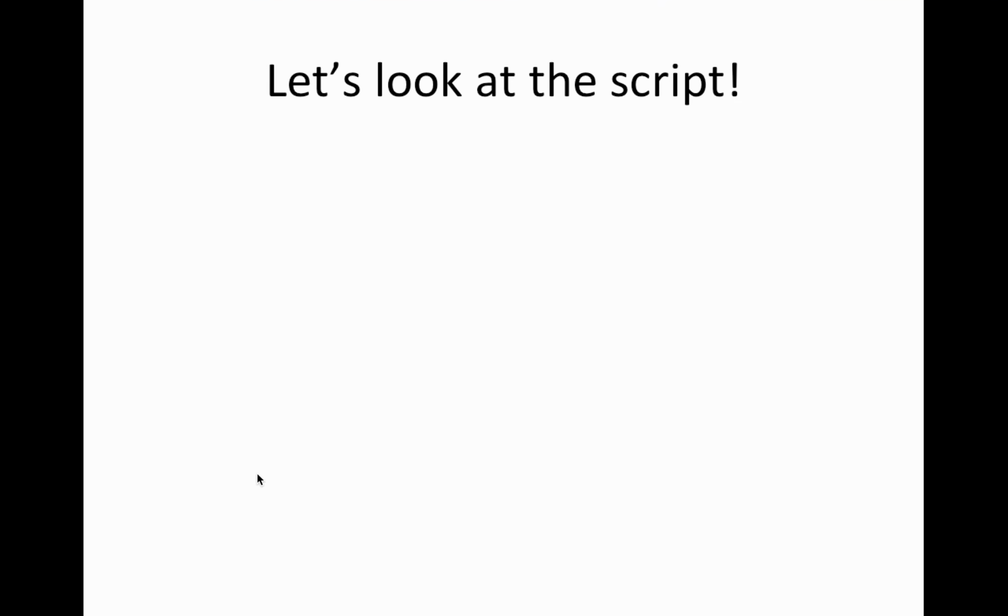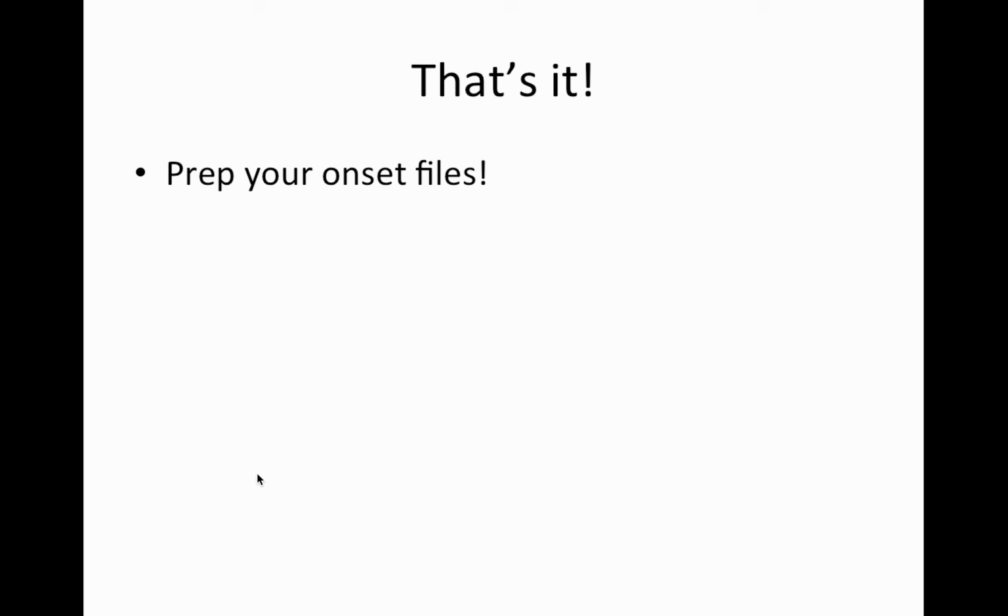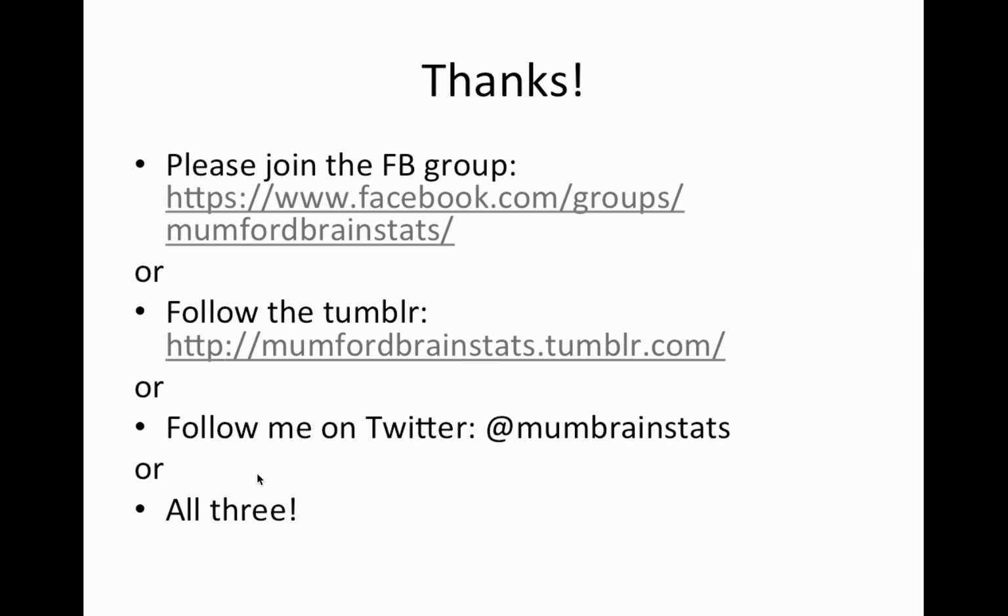All right. That's it. Again, prepare your onset files so you're ready and run this script. And again, take your time and play, try to break it, try to come up with a better way. If you come up with a better way than me, let me know so I can change it.